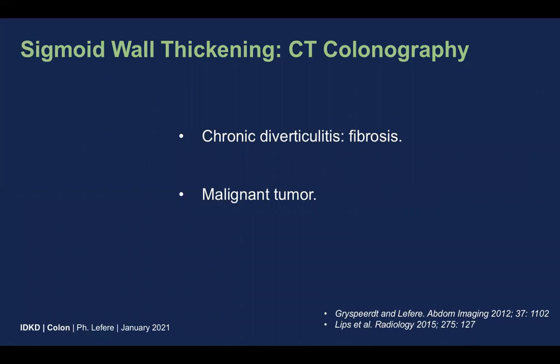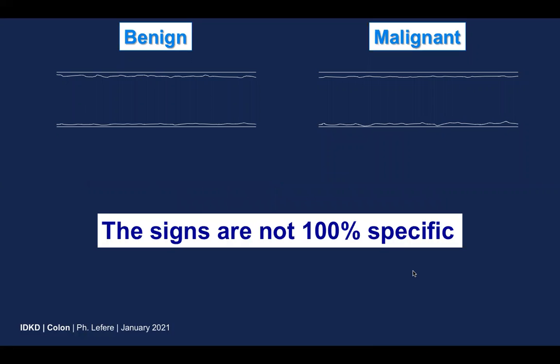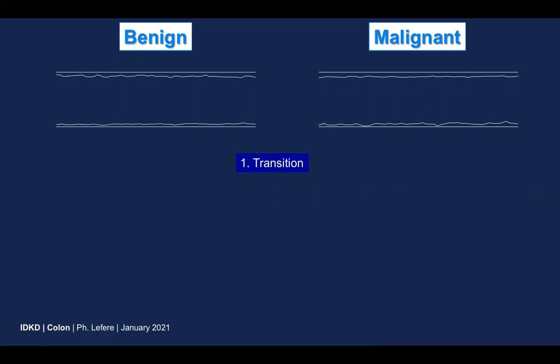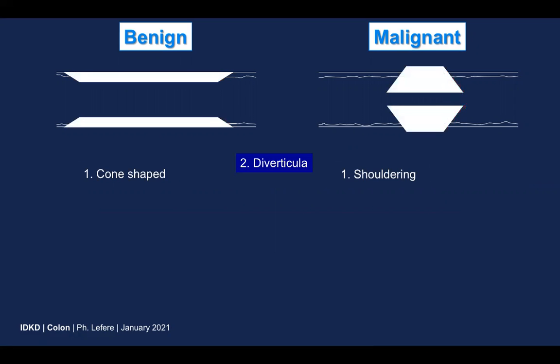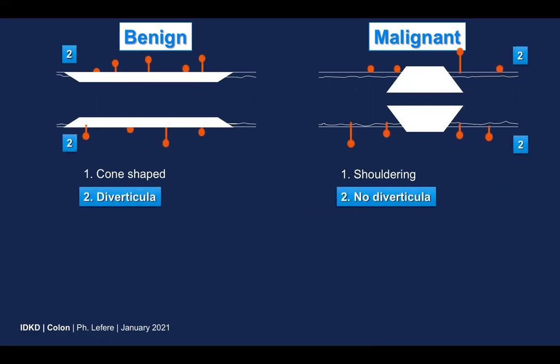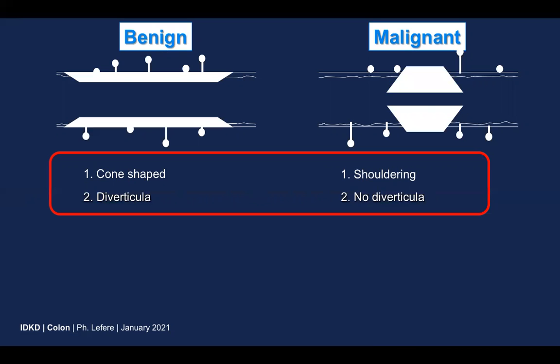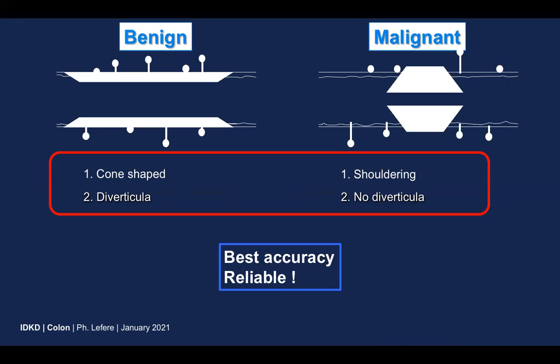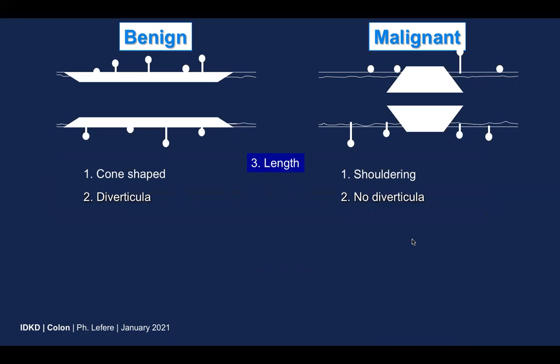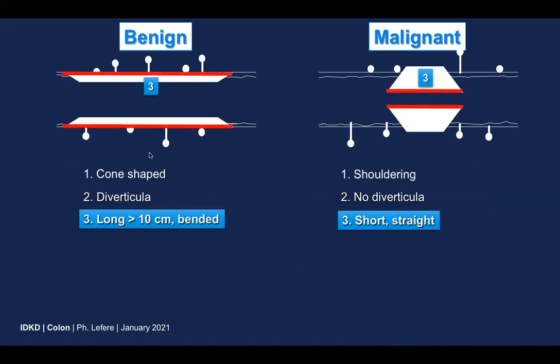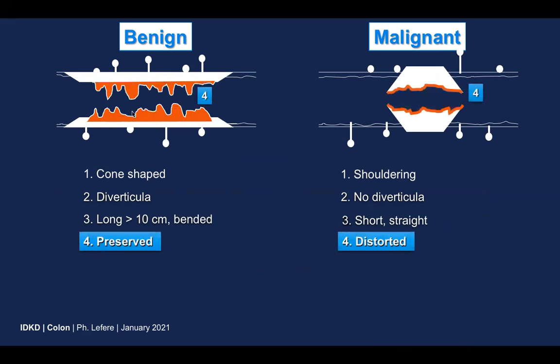I want to end with the differentiation on CT colonography between chronic diverticulitis and malignancy. This is not always easy, and we need to look at several signs, which are not 100% specific. Very important is the transition zone: cone-shaped versus shouldering. Presence of diverticula is also key — combining these signs gives the best diagnostic accuracy. Cone-shaped aspect with diverticula is most probably benign. Less specific signs include segment length — mostly long in benign disease, mostly short in malignant — and folds, which are mostly present in benign disease but distorted or absent in malignant disease.